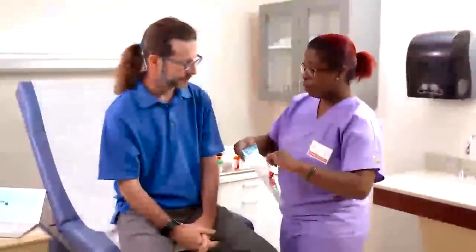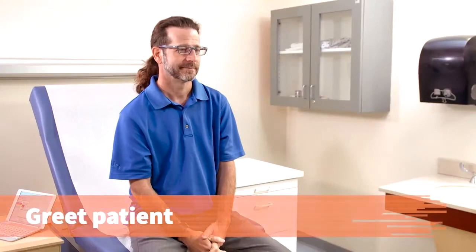In this procedure, you will learn how to instruct a patient in the proper collection of stool for an ova and parasite microscopic examination. Greet the patient and identify yourself.